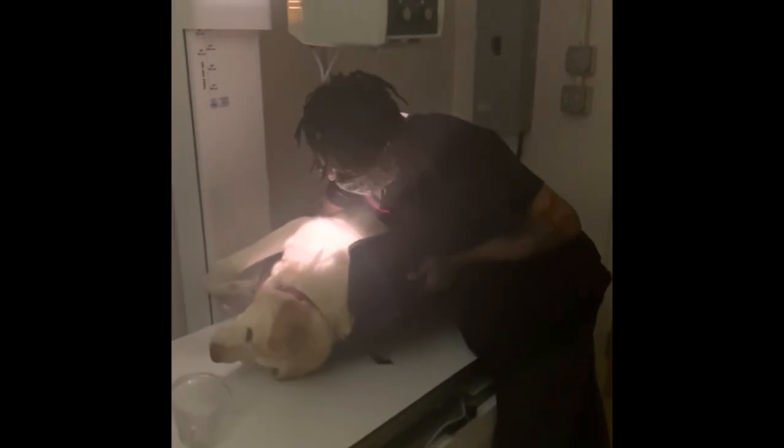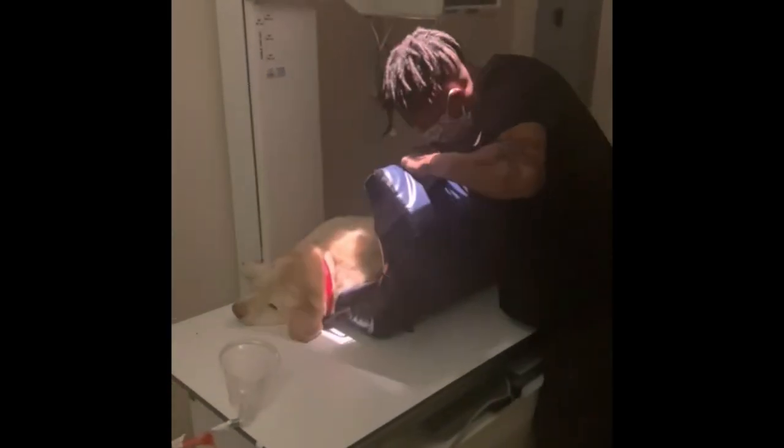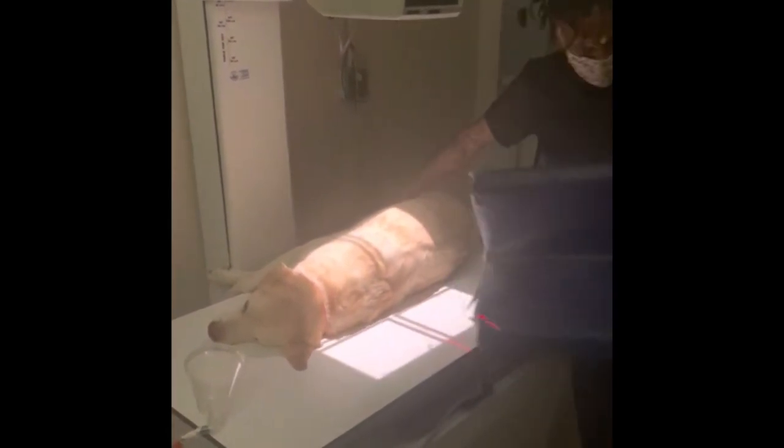Next I'm going to take my left lateral x-ray — left lateral meaning the dog is laying on his left side. I carefully roll him on his side by slowly turning the trough and rolling him off of it. Remember to be careful because too much movement and noise can cause him to react and wake up.